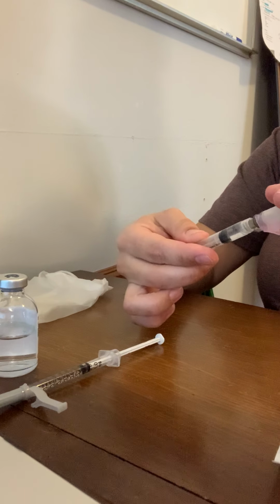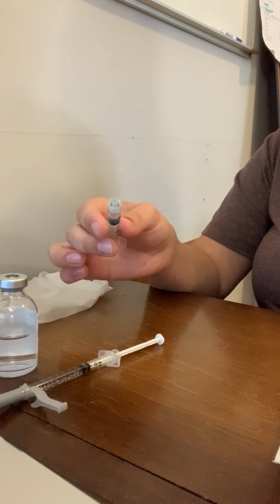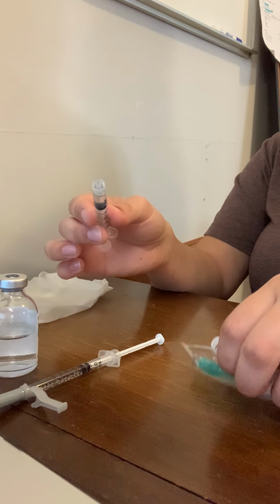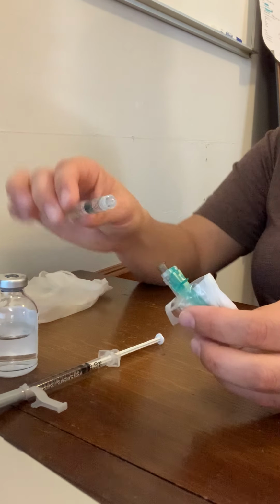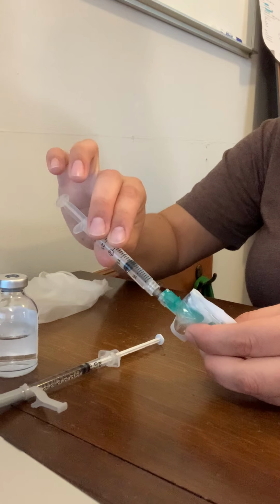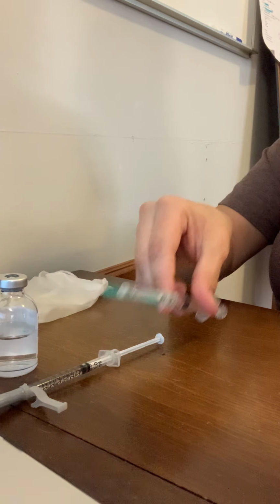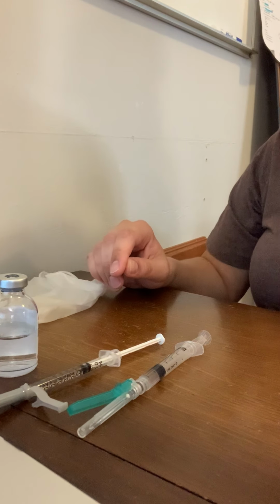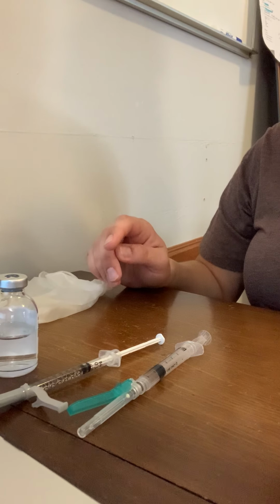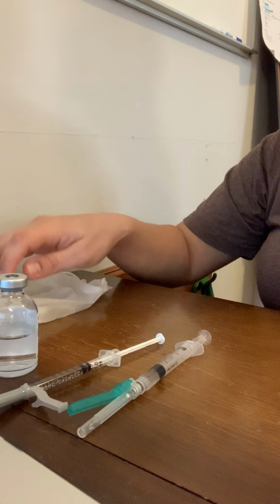I am going to discard this needle into the sharps container and change into a sterile needle. I'll just do it right from the package so I don't compromise my sterility. And my Phenergan is ready to go. Now I'm going to gather all my necessary equipment to go to the patient's room.